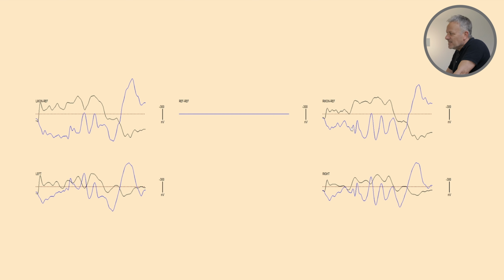And yes, it looks like the presentation file actually created nicer traces, whereas remember, we stimulated on the Surpass, we stimulated the actual left ear with a suppression of the right ear with minus 30 decibels, whereas with the presentation file, we stimulated both ears. That's why we're getting quite good responses using the presentation stimulation method, using one-shot triggering.